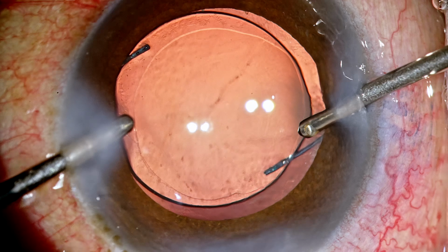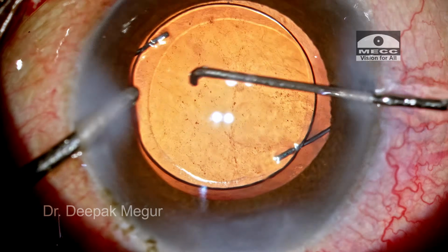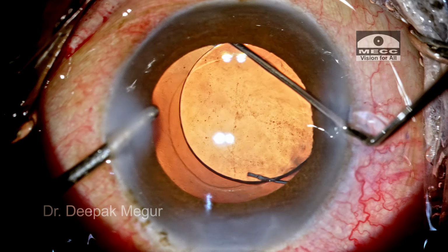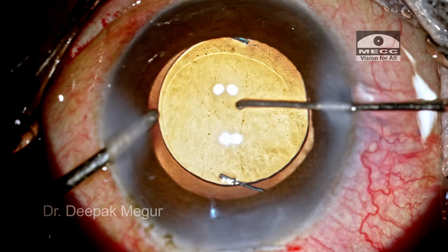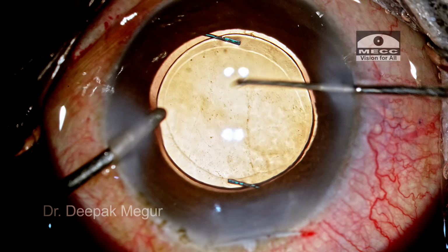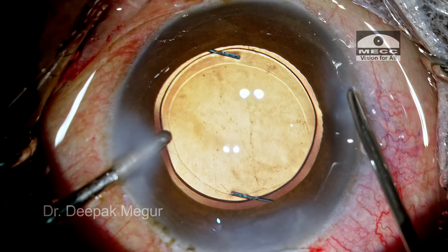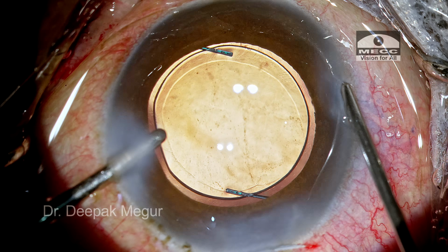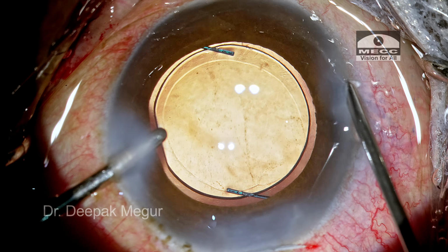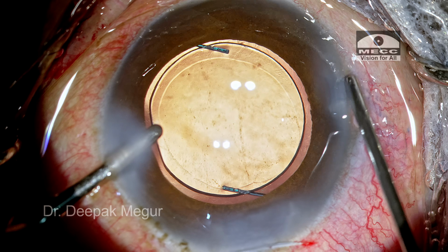Now, once I'm certain that the vitrectomy is done and adequate, I go in and dial the lens so the haptics are away from this area. I'm still continuing to do a little bit of vitrectomy at the wound just to confirm that there is no vitreous left at the wound. Now, the pupil is quite regular in that area. There's no peaking, which suggests that there is possibly no vitreous strand coming across.